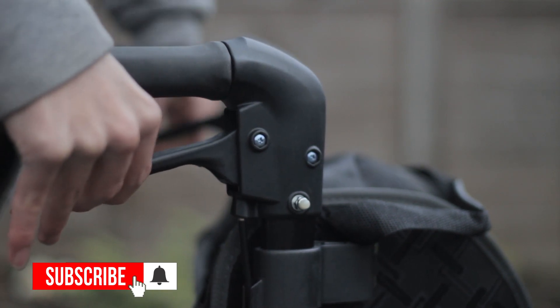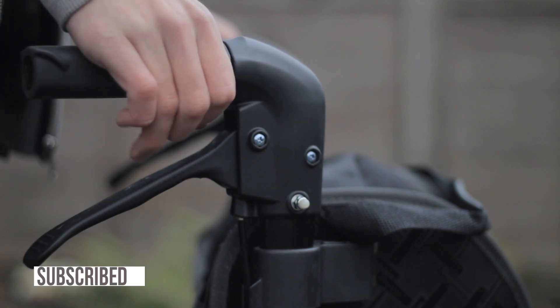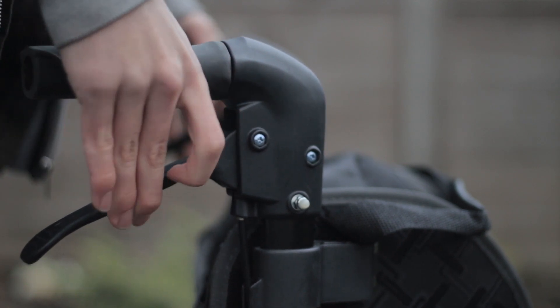When the product is stationary you can lock the brakes by pushing down on them. Doing this will keep the rollator in place and stop it from rolling.